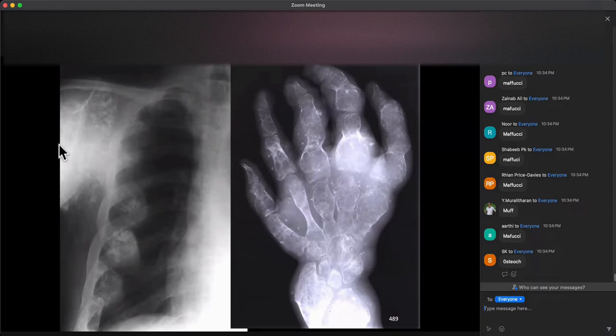Yeah, so we've got Ollier's disease, so multiple enchondromas, and we've got multiple phleboliths. So this converts the Ollier's into a patient with Maffucci syndrome. And Maffucci syndrome is of interest because it's more likely to result in malignant change. So the fact that we've got phleboliths in association with enchondromas means that we're likely to be dealing with Maffucci syndrome, which obviously has a higher incidence of chondrosarcoma.